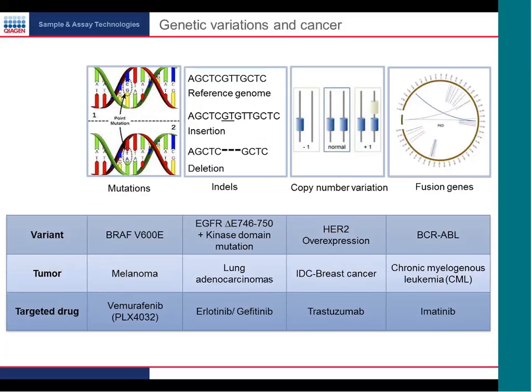As you all know, DNA is the basic unit of genetic information, and any change in DNA sequence can lead to a physiological or phenotypic change. These changes can vary from single nucleotide mutations to insertions, deletions, copy number changes, to fusion genes. And it's very important to detect these mutations. Not only do they serve as diagnostic and prognostic markers, but they also help us in selecting the proper treatment for our patients.